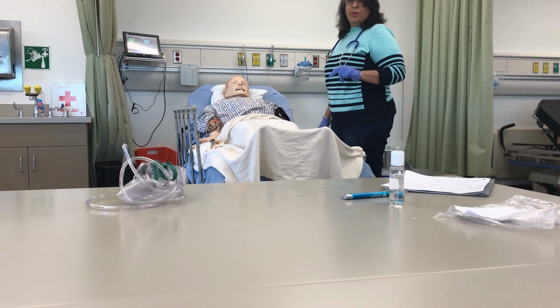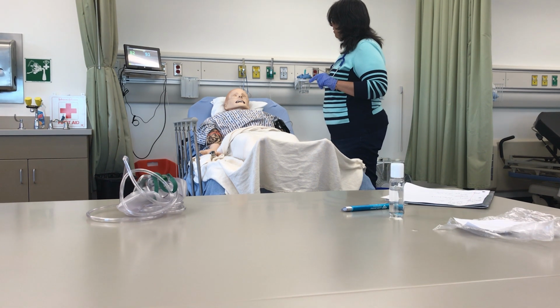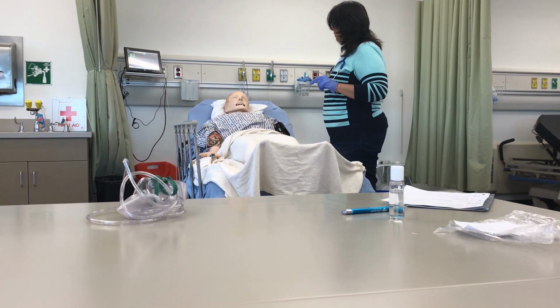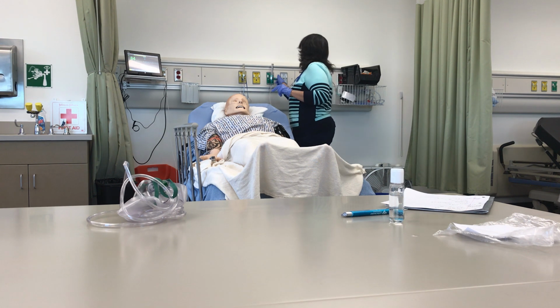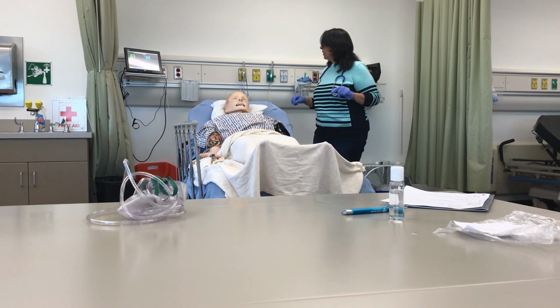I know it sounds a little squeaky, I don't know why, but that's okay. It's just me. Oh, we're desatting, 93%. So we wanted to keep our sats up. Yeah, I think we'll just keep you on the oxygen for now. Just bump you up to 2 liters. You're not quite ready to get off that, so there you go.